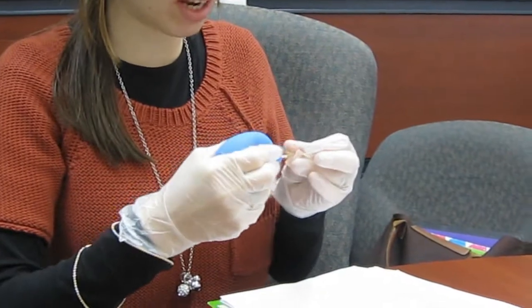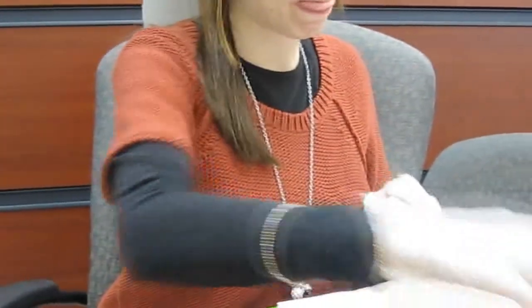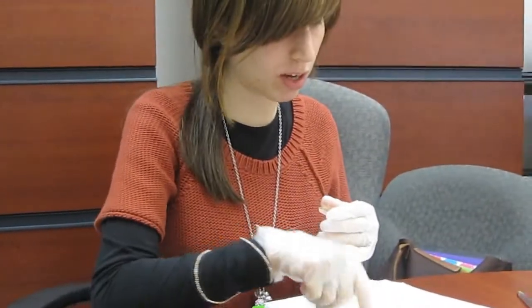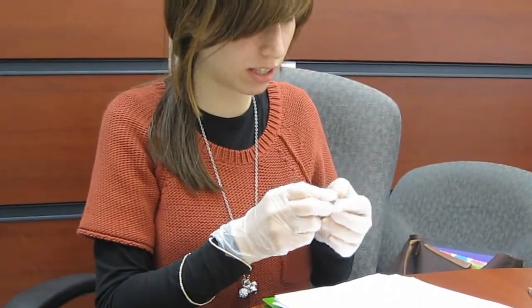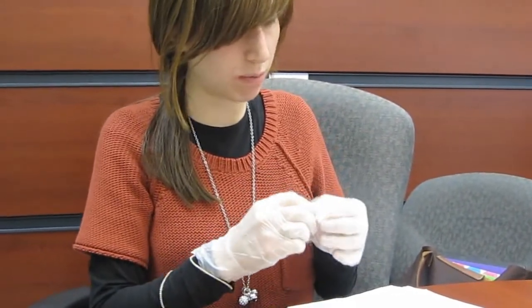We're going to see if there's any moisture in here, so we're going to use this. And it's not, it looks pretty clean. It's a little bit yellow, but it looks pretty clean otherwise. Now, when we hook it on, we want to just make sure that it is securely fastened.